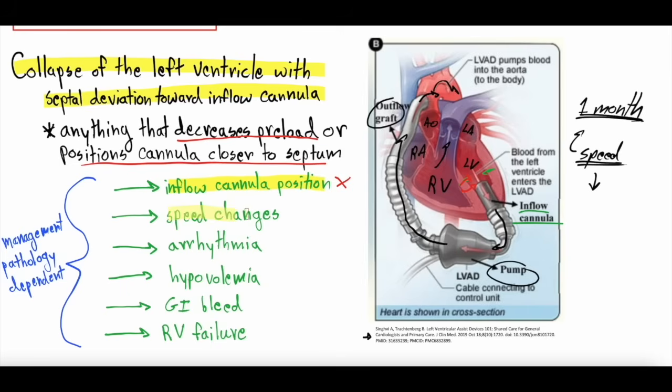Speed changes is another one. As we talked about, the rate at which the LVAD is sucking blood out of the left ventricle is going to contribute to this left ventricle collapsing.